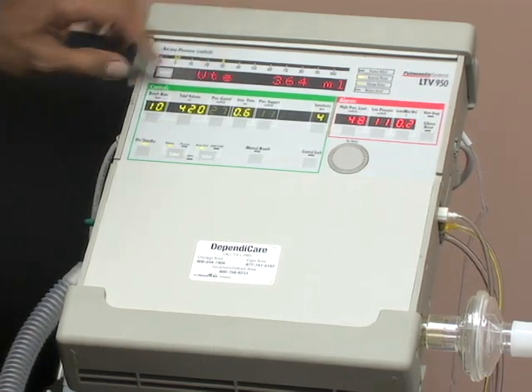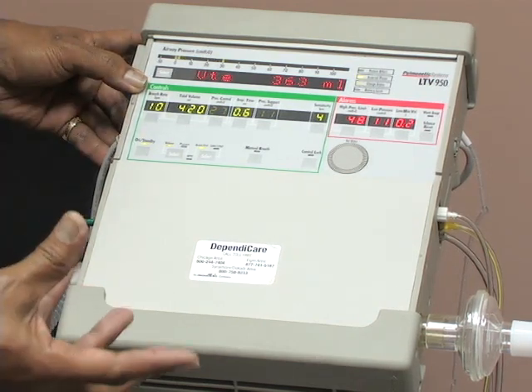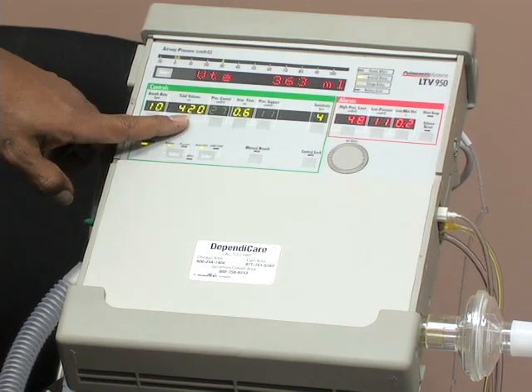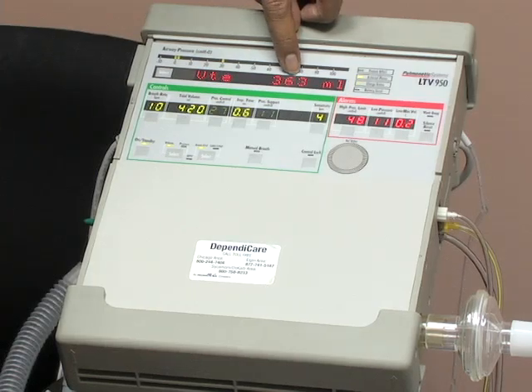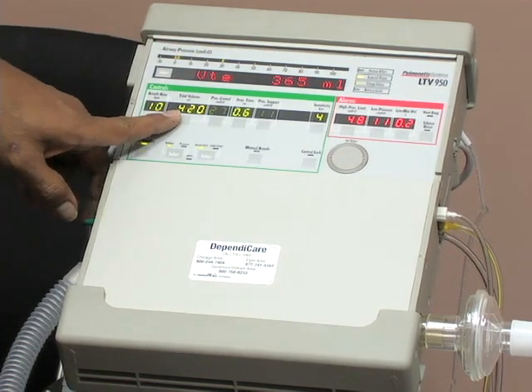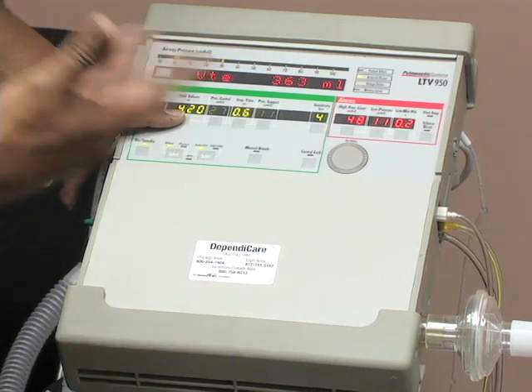It tells us what's going on with our client right at this point in time on each breath. The tidal volume, as you can see, was set at 420 milliliters to be infused. But this tells us how much actually came out. So by looking at how much came out, it gives us an idea of whether our client is getting the actual prescribed amount on each breath.